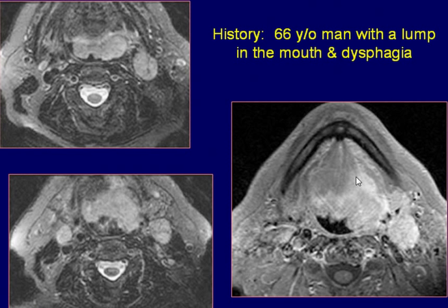The axial fat-saturated gadolinium-enhanced T1-weighted image at a more caudal level shows the mass extending inferiorly and laterally. On the left side, the left parapharyngeal space is involved.